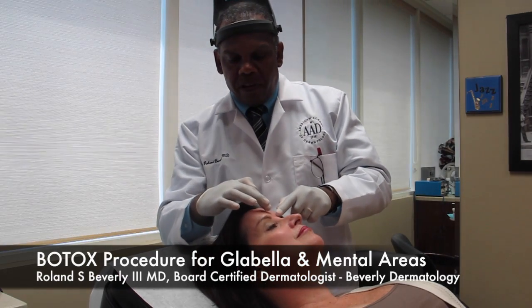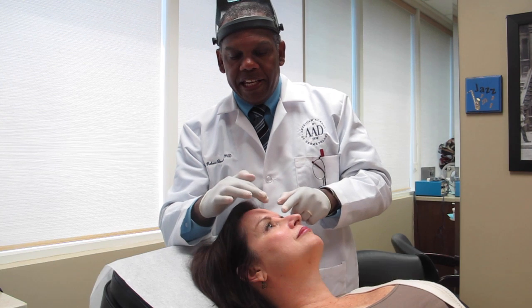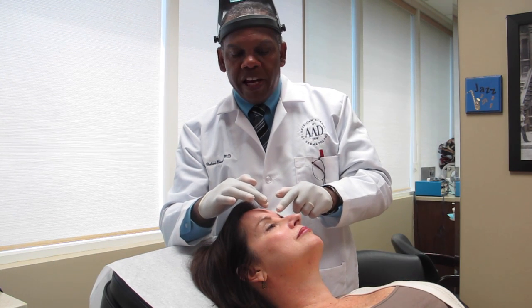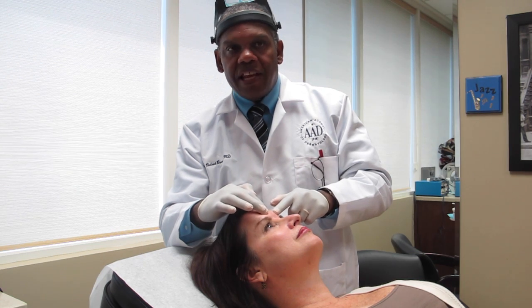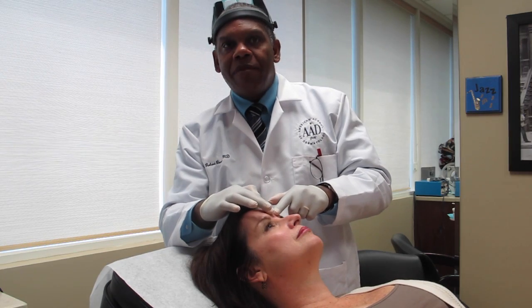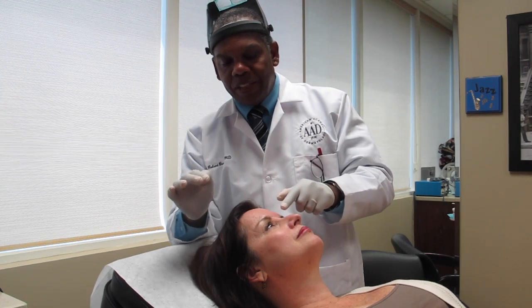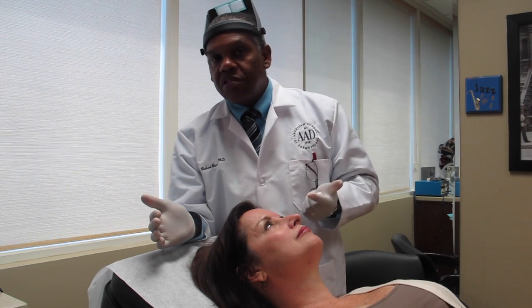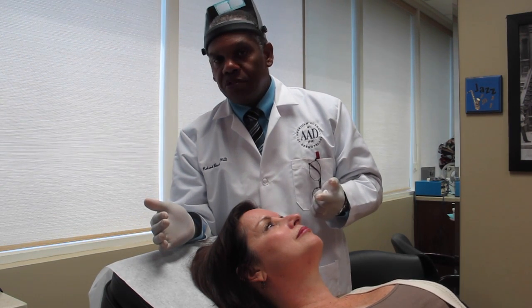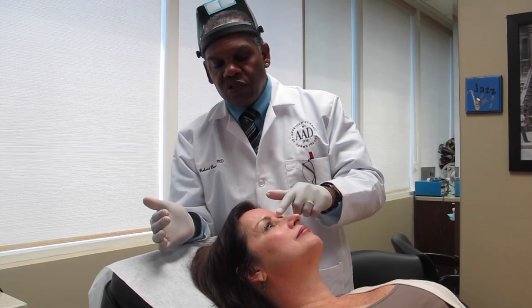What we're doing now is putting a little bit in the glabellar area. For some people with a scar here, this will help soften the area by preventing the skin from scrunching, giving us a flatter, more uniform appearance. Obviously different amounts can be required for everybody — could be as little as 10 or as many as 25 units. Today we're going to use 15 units.